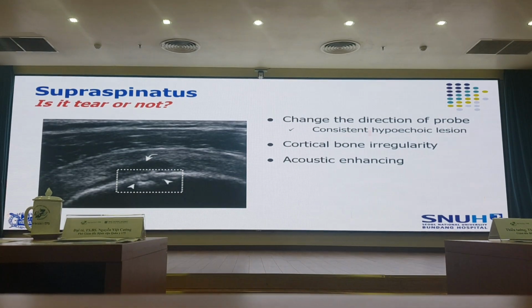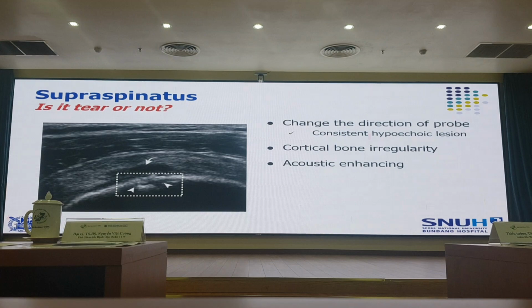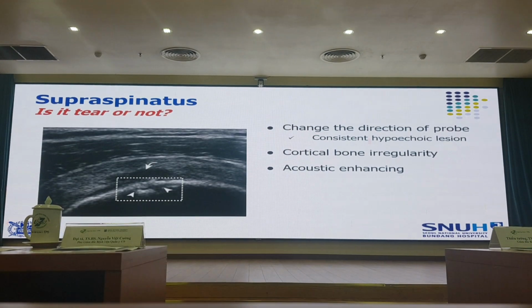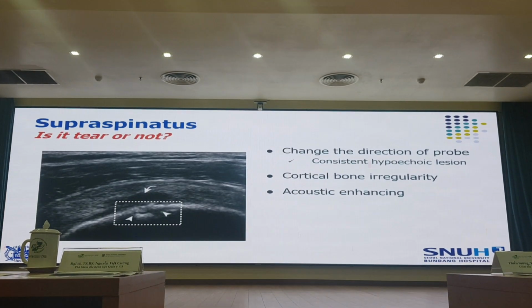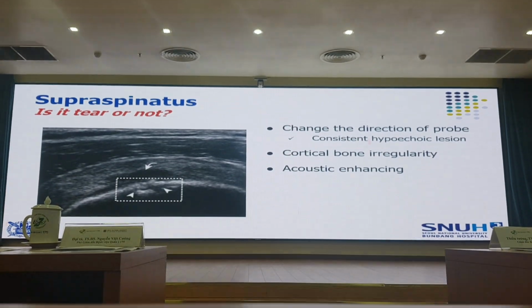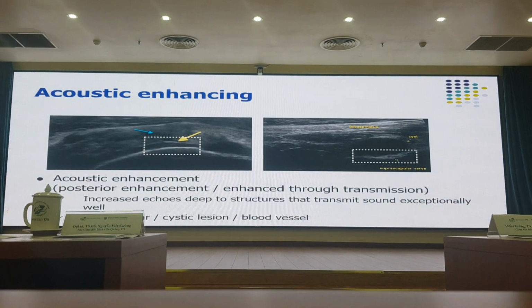Và một cái nữa là một cái tăng phản âm, tức là nếu mà cái vùng chóp xoay nó bị rách và chỗ đấy nó có dịch ở trong đấy và các bạn biết là dịch thì nó sẽ làm cho cái phần phía sau nó phản âm nhiều lên, và khi các bạn nhìn thấy phần phía dưới mà phản âm nhiều lên tức là phần trên của nó là dịch ấy, thì nghĩa là chỗ đấy là chỗ rách chóp xoay. We called it as acoustic enhancing or acoustic enhancement.